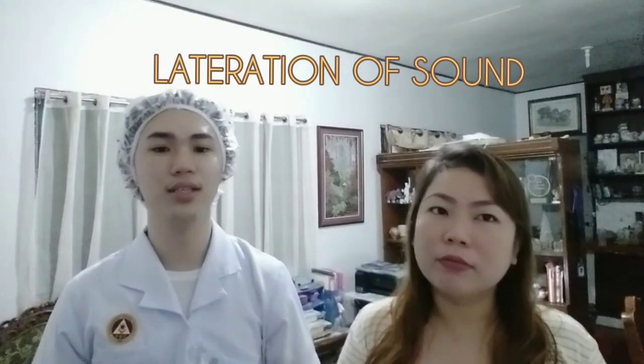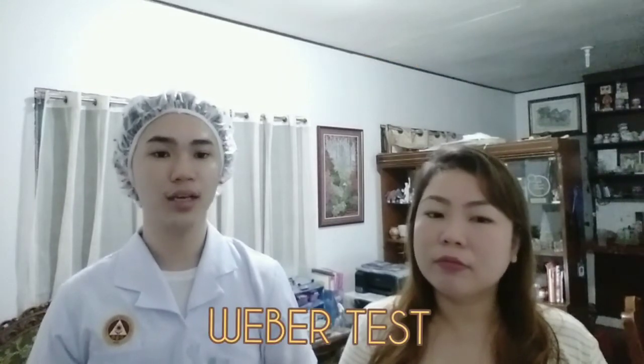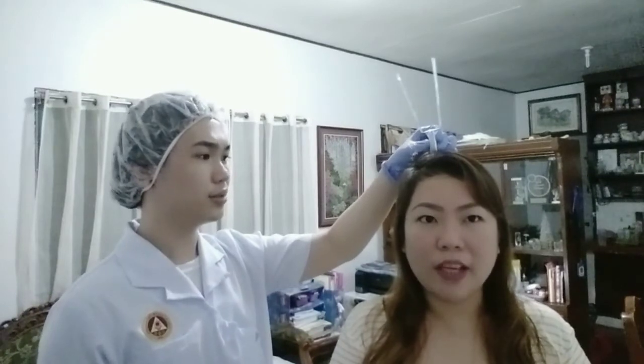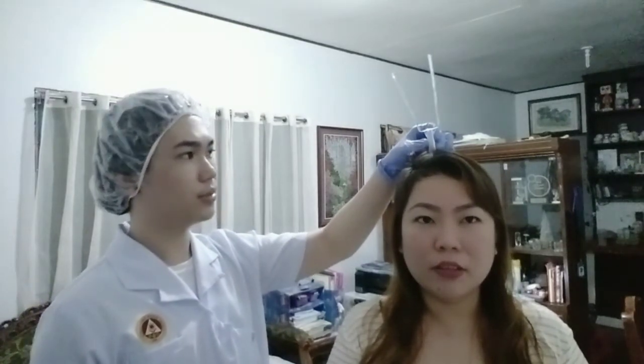So first is the Weber test. In the Weber test, I'm going to place an activated tuning fork on the center top of the client's head. So ma'am, I'm just going to put the tuning fork. Do you feel any vibration? Yeah. In your left ear? Yes. How about your right? Yes. So after the Weber test, now it is the Rinne test.